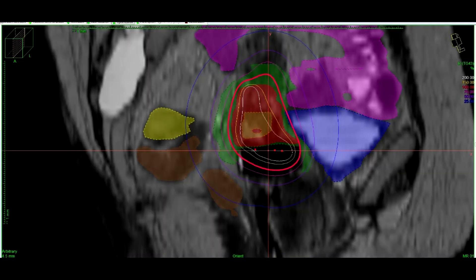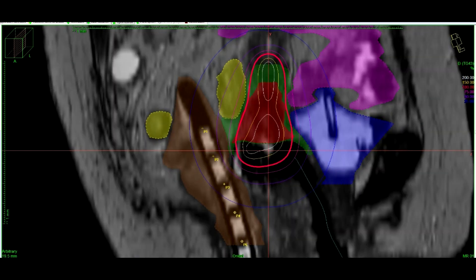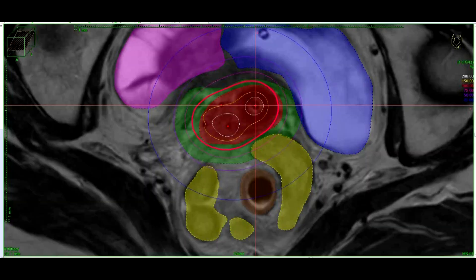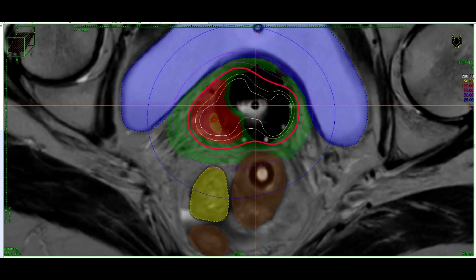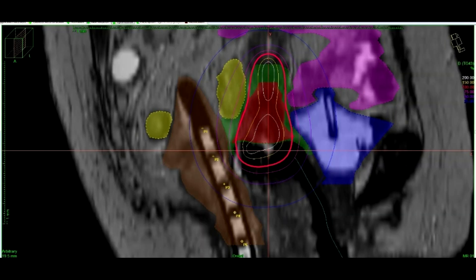Here you can see a demonstration of absolutely artifact-free sagittal magnetic resonance images. As you know, water we see as a white color, and air, catheter wall, and diode imitator plastic we see as a black color. That is the diode numbering: P1, P2, and so on.